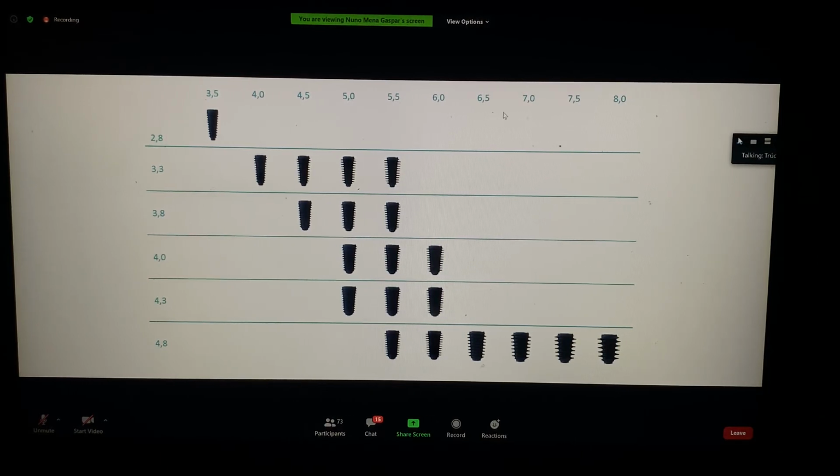Và tôi cần cái lõi bên trong to hơn, thì tôi dùng lõi là 3.8 và đường kính implant là 4.5. So this is another advantage of the Enerich implant. I can choose a stronger core implant without having the need to do much more drilling. I just need to reduce on the cortical, like I did with the 7mm burr.